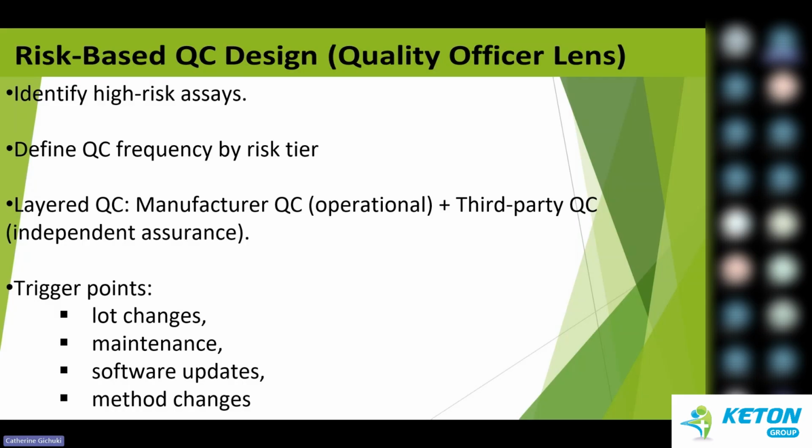Always run QCs after reagent lot changes, after software updates, after maintenances, after method changes. The higher the risk of a test, the more often and the more independently we should check it.